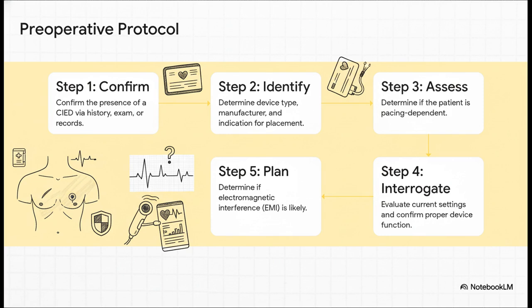Step 4, you need that interrogation report. You have to know the current settings and battery status. And finally, Step 5, look at the surgery. Is electromagnetic interference, or EMI, likely? Because that one question is going to dictate your whole intraoperative plan.